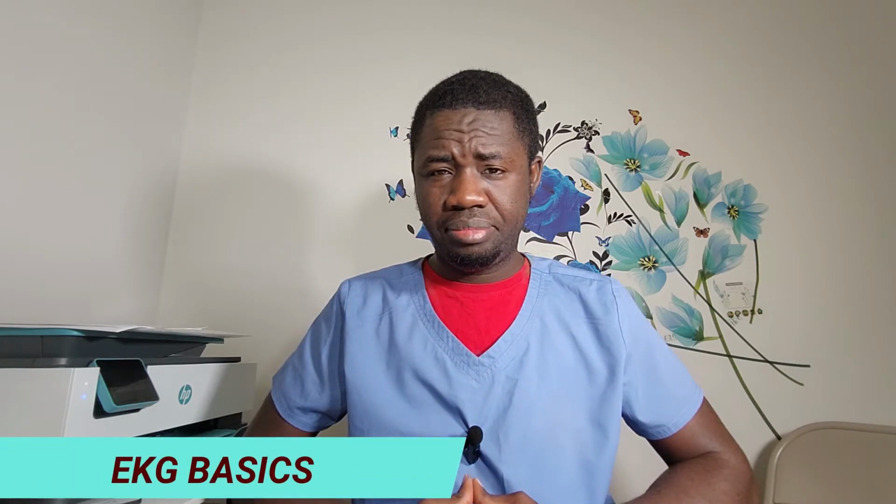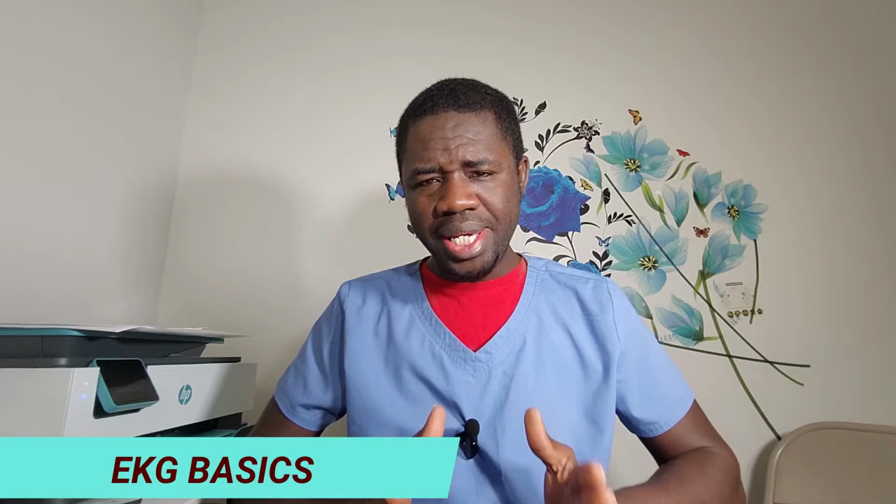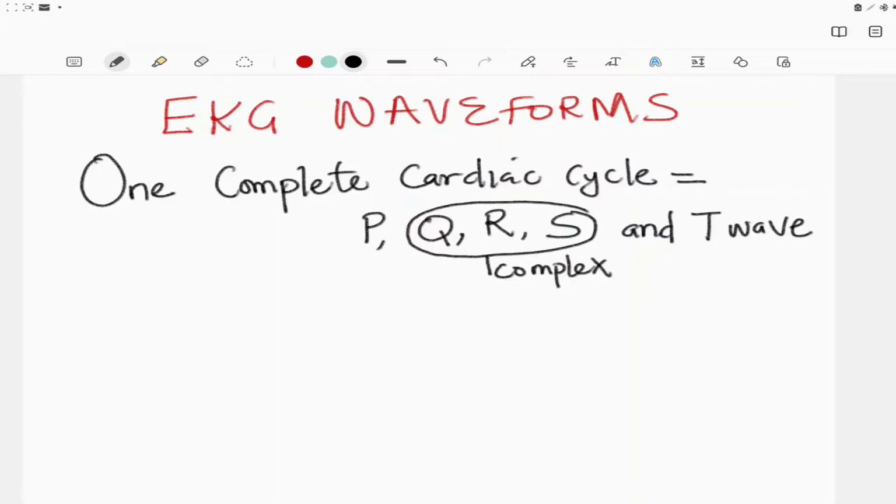Now let's talk about EKG waveforms. A complete cardiac cycle means that there is a P wave, QRS complex, and T wave. So a complete cardiac cycle must have a P wave followed by a QRS complex and followed by a T wave.